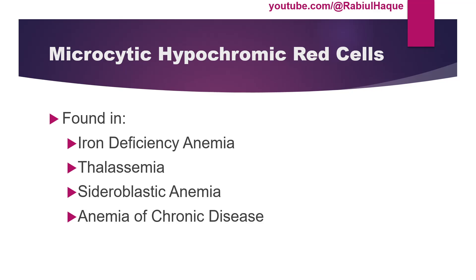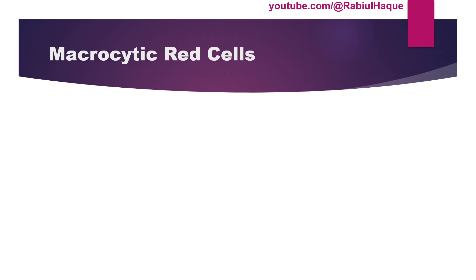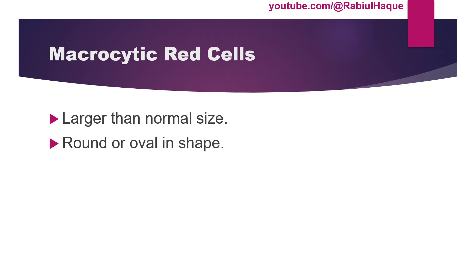Red blood cells can also become larger, and that term is known as macrocytic. Here the red blood cells are larger than their normal size and they may be round or oval.